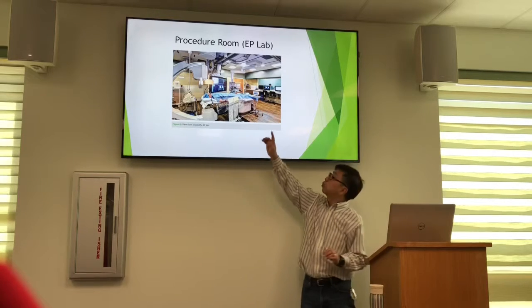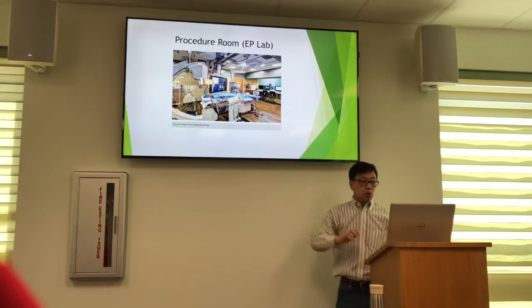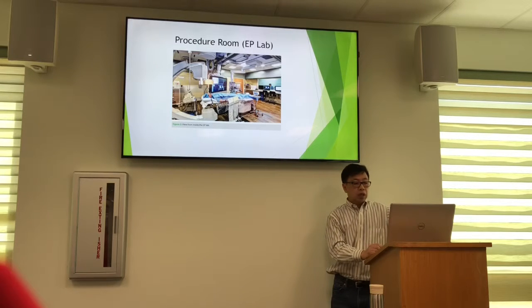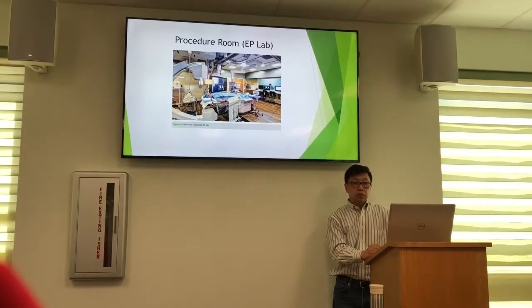One person in the corner will record the procedure in the medical recording system. The circulator will drop supplies and equipment for the team. The scrub will help implant devices. Anesthesia will provide anesthesia service. And the physician. Lastly, the pacemaker vendor will supply the pacemaker and program the device during the procedure.